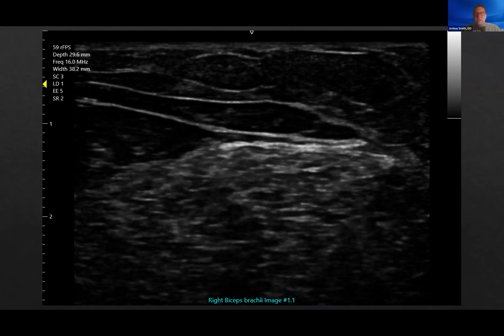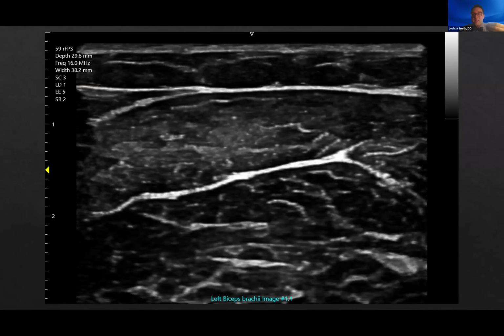So you want to make sure at this point, I think ultrasound is a good one to be like, oh no, my needle looked abnormal, the echodensity looks abnormal, based on their strength it's not end stage. This is a good muscle that's likely to give me good pathologic information for the patient. So again, here's just an example of normal muscle.